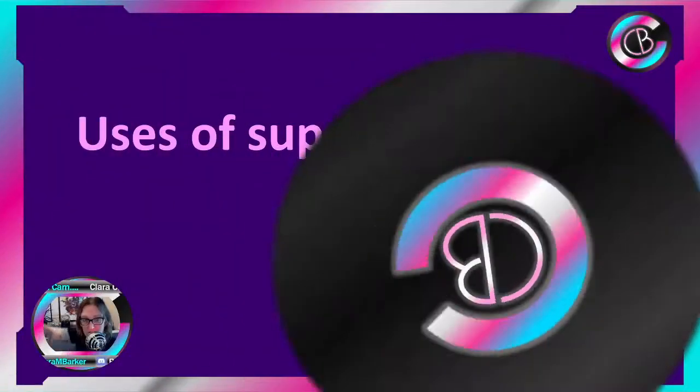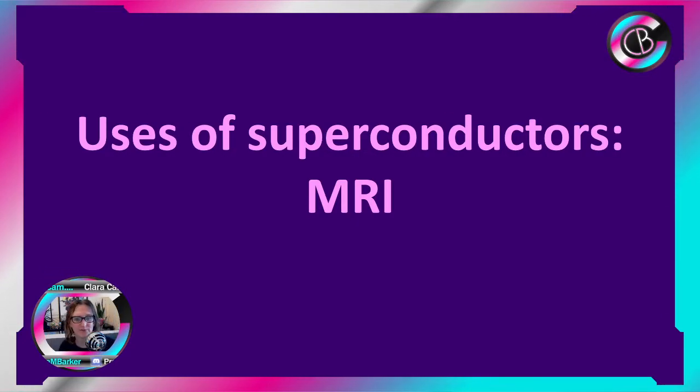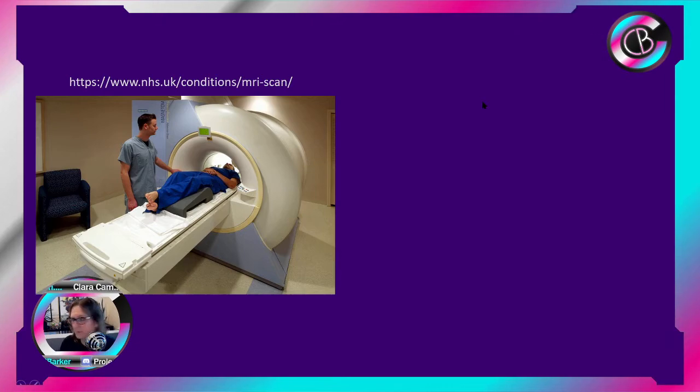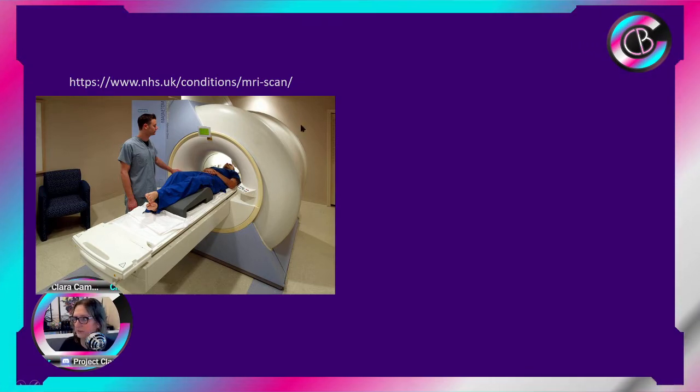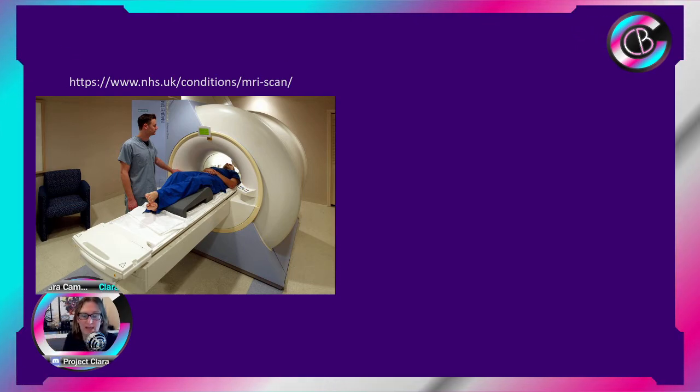Anyway, let's get on to the science of MRIs. So what's going on? We're using our superconductors in MRIs. I pulled an image of an MRI from the NHS webpage, which is the British healthcare system at the moment. It's basically this big circular ring.